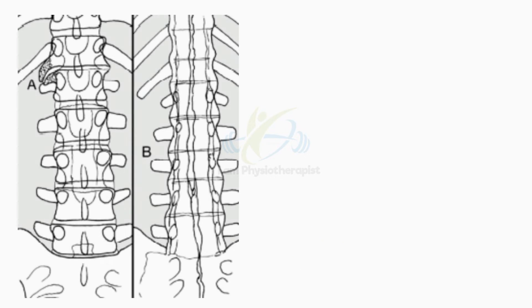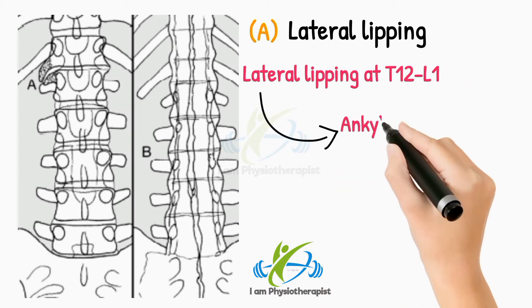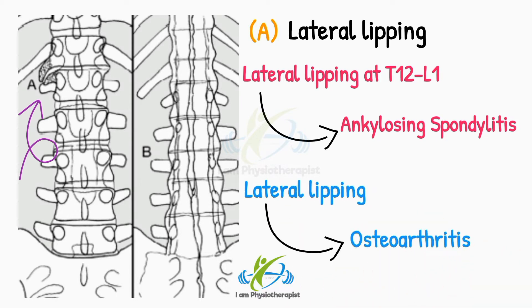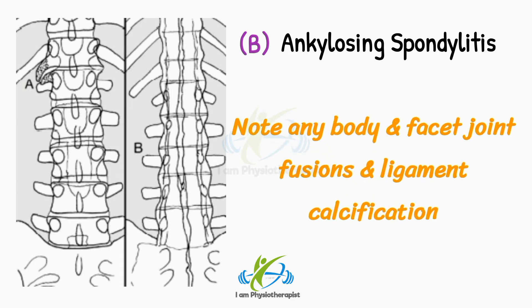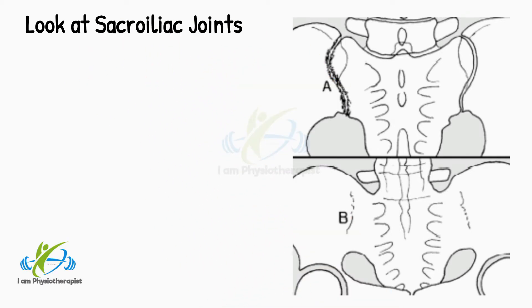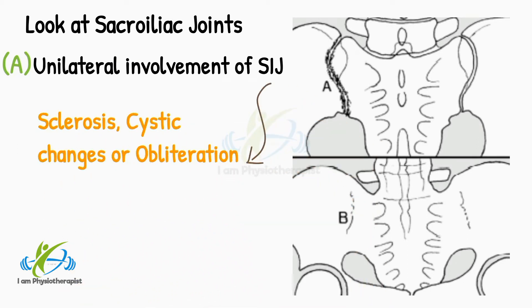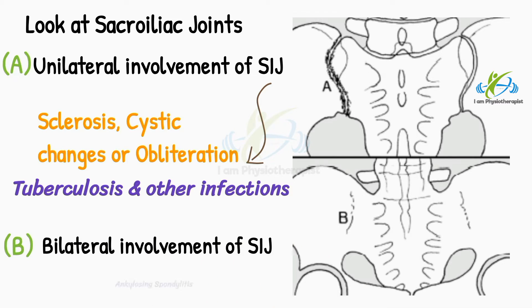Look for lateral lipping as shown in point A. Lateral lipping at T1 to L1 may be an early sign of ankylosing spondylitis, but there and elsewhere it usually indicates osteoarthritis. Picture B is the diagnosis of ankylosing spondylitis — note any bony and facet joint fusions and ligament calcification. Look at the sacroiliac joints. Point A shows unilateral involvement with sclerosis, cystic changes or obliteration, which may occur in tuberculosis and other infections. Bilateral involvement, as shown in point B, is common in ankylosing spondylitis.